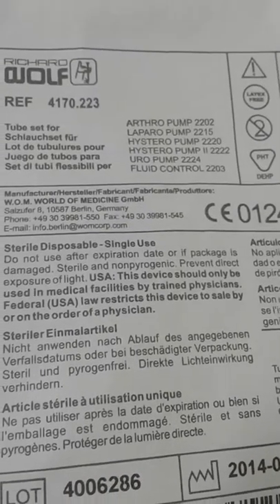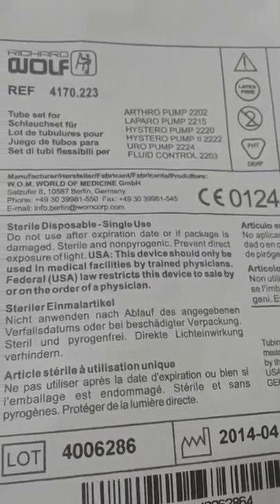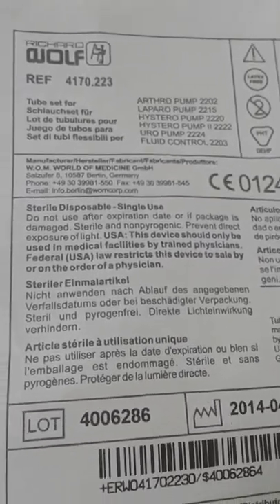Richard Wolf with this reference number starting with 4 means it's single use. Starting with 8 means it's reusable. From 4, I think we brought about 20 pieces, probably. Maybe they kept them in the store, I don't know. So even if you didn't use it for the procedure, didn't connect it to the patient, it will count. Yes.